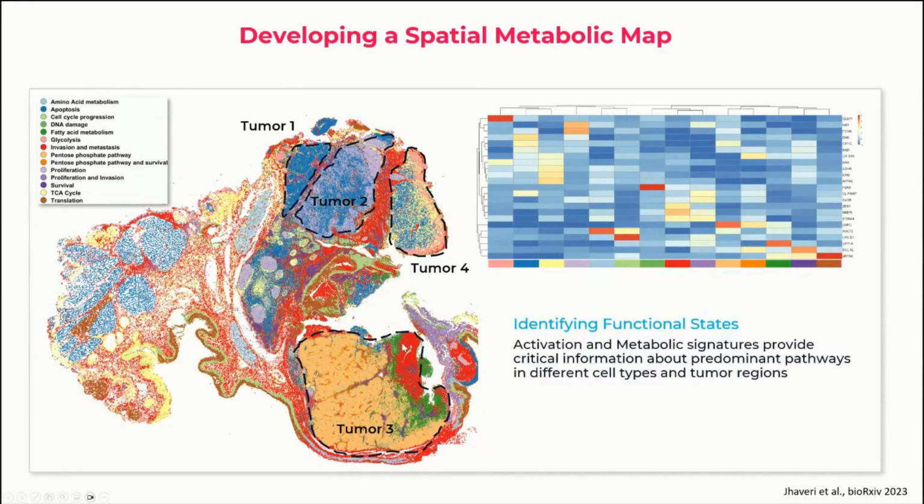And we think that's the likely leading edge of the tumor, and that's the area that's spreading. That's the area that's metabolically active, and that's ultimately what's going to kill the patient. Whereas in tumor regions 4, 2, and 1, we can see increased expression of pro-apoptotic pathways, and that's your dead or dying or necrotic tissue.